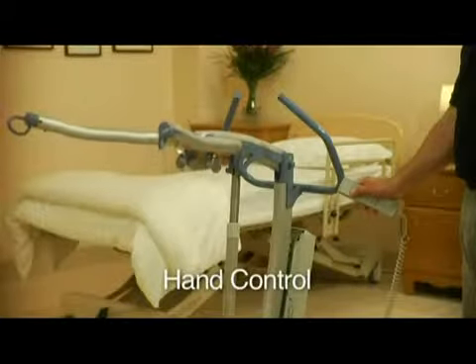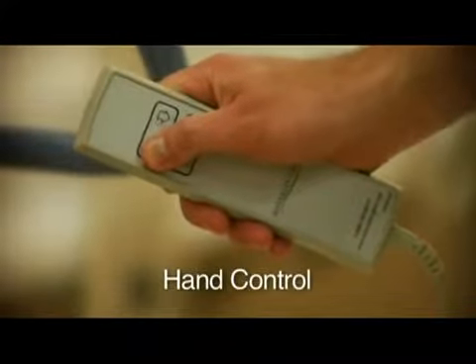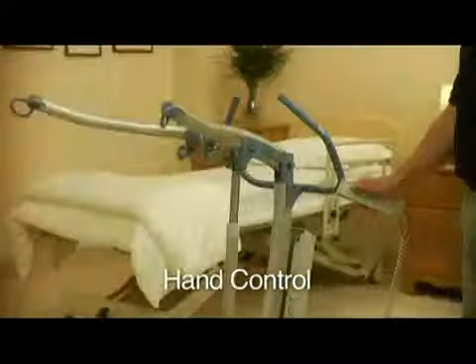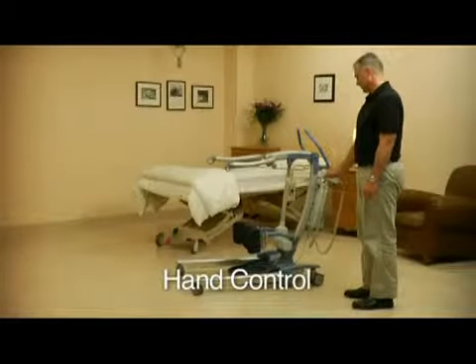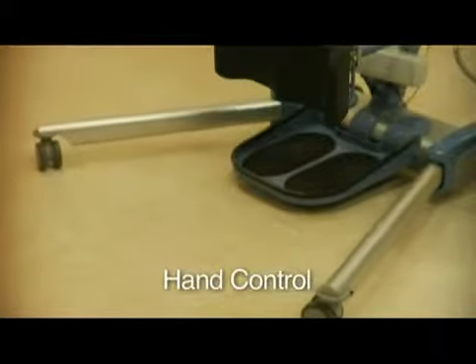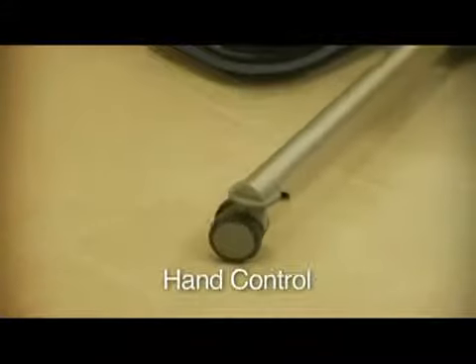Using the hand control, you can raise and lower the S440's boom and open and close its base. Pressing the button with an arrow indicating up raises the boom, and pressing the one with an arrow indicating down lowers it. Pressing the button on the left opens the base, and pressing the button on the right closes it.